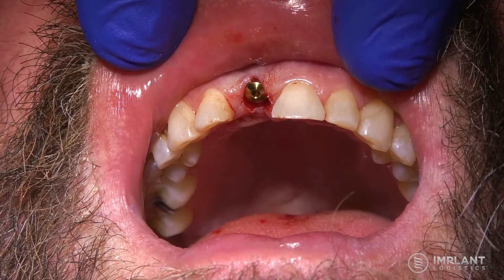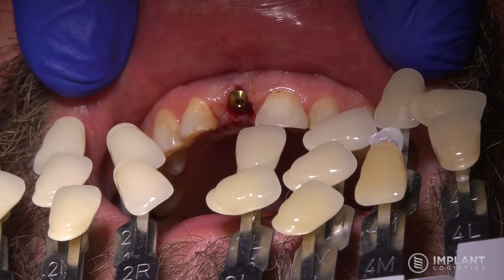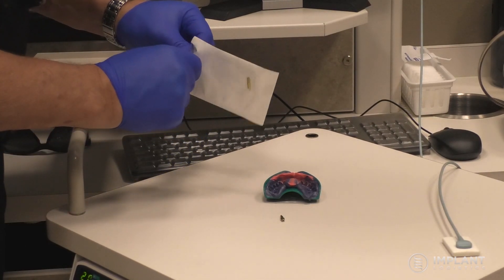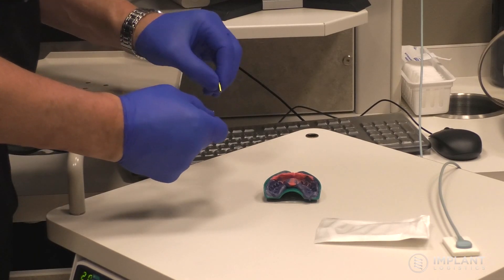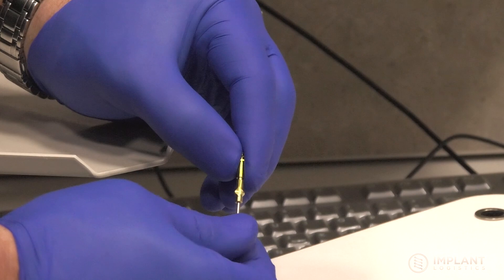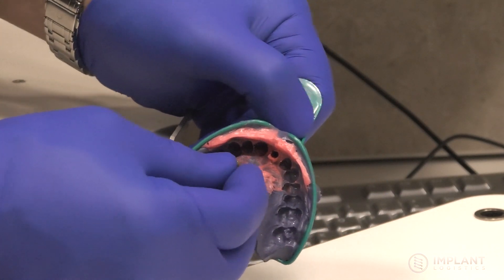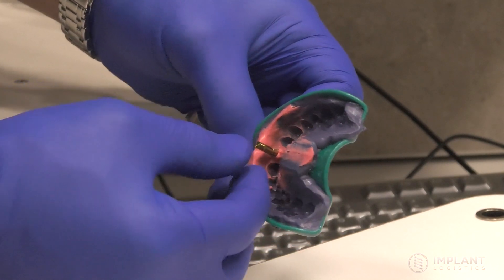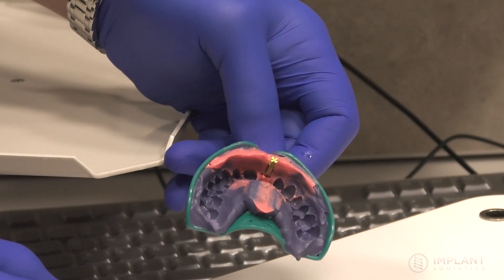The tissue will heal around that healing cap. It won't develop a perfect tissue profile — it'll be a rounded profile. So the process you saw to uncover the implant you might do again when you place the crown so that it's fully seated. Once the impression is completed, the next step is to take the analog for a Series 2 implant — again yellow in color — attach it to the impression post and insert that into the impression. The same 050 hex driver will secure these two pieces together. The fewer times you insert that impression post into the impression the better, as taking it in and out several times could potentially distort and make your impression less accurate. And that's pretty much the end of the uncovering and impression protocol.